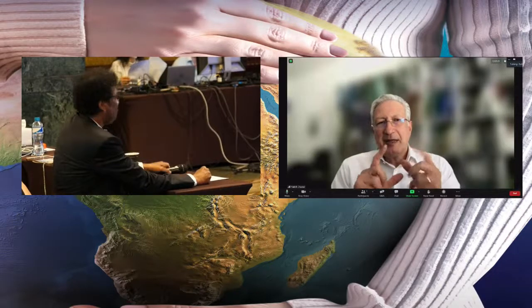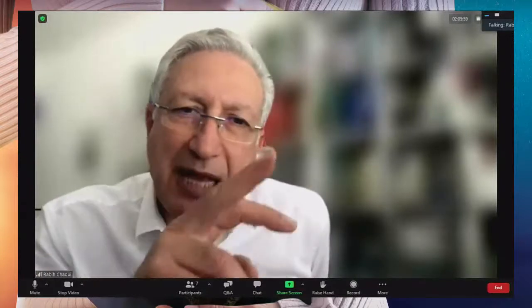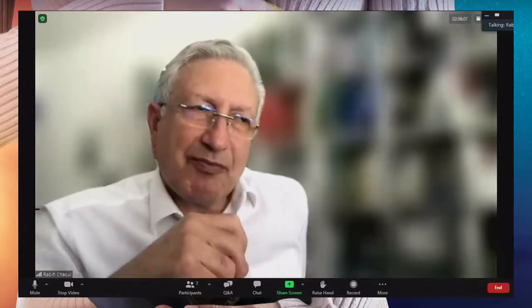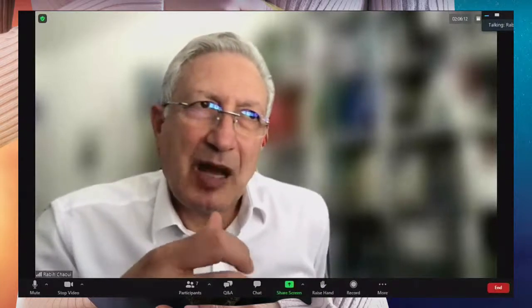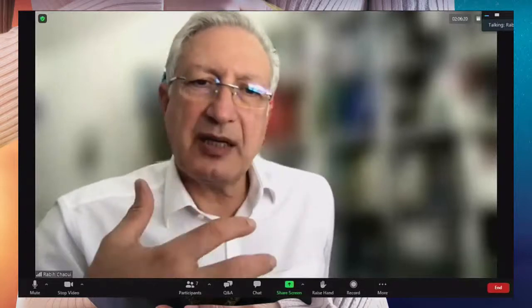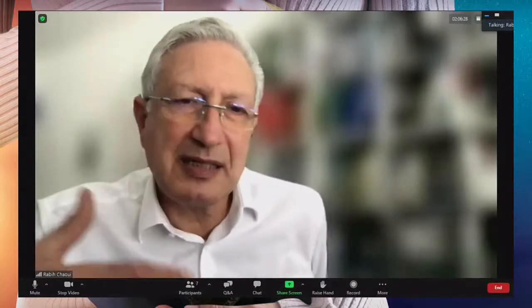Thank you. Yeah, you are absolutely right, but this is always the case in technology. I don't know if you know the hype cycle, there is a curve where it goes up and then it's forgotten and it will come back. You will see it will come back. But to your and my experience, STIC technology, biplane and so on, are very well in the hands of a semi-expert or expert, and they often need the fetus in a good scanning position. And this needs some expertise, and this is why many people are still hesitating.